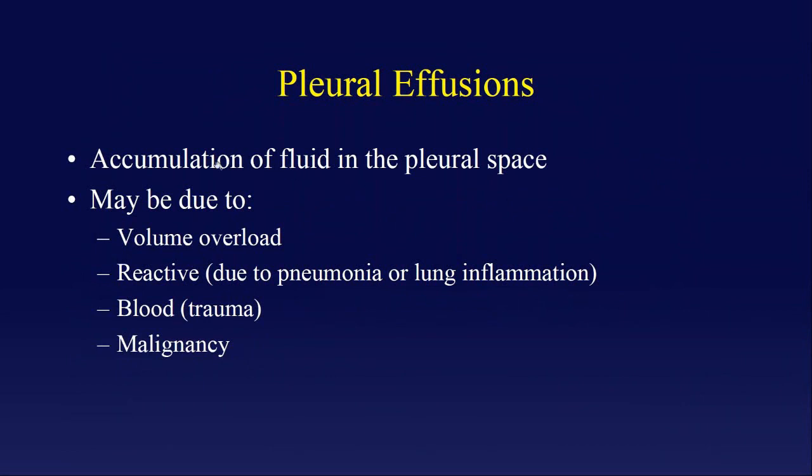I did a flashcard on the management of spontaneous pneumothorax, small versus large. It said a small one is less than 2 centimeters air rim on chest X-ray at the hilum, and a large one is greater than 2 centimeters air rim on chest X-ray at the hilum. What is the air rim on chest X-ray at the hilum? What does that refer to?